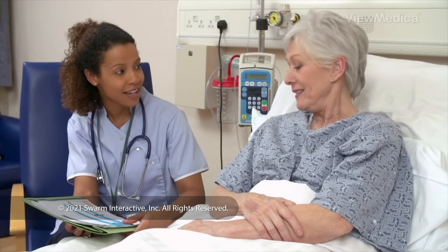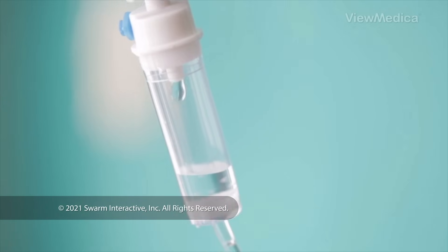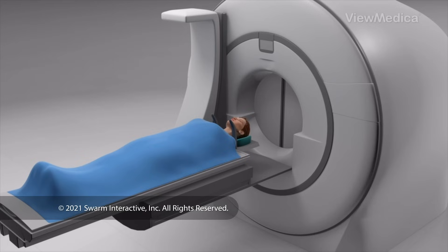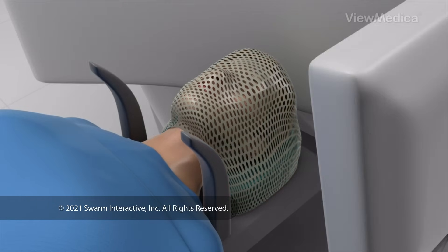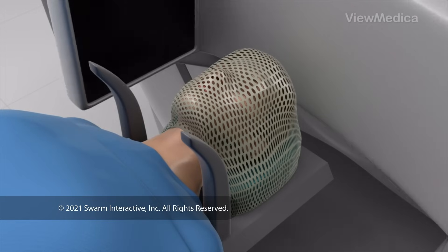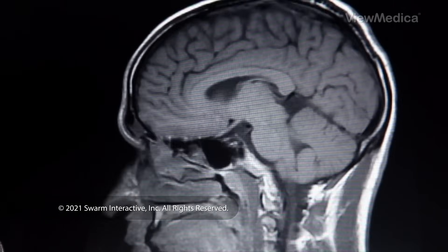How is it done? You'll most likely be awake for the procedure. You're given medicine to make you feel relaxed and comfortable. We numb your scalp and secure your head with a frame or a mask. Then you'll have one or more imaging scans, which gives us a detailed view of your brain. We study the images to find and target your AVM.